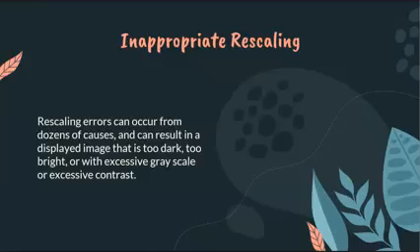Okay, but that is not the case for CR systems because as you can remember, ang pag-scan ni CR system is kinascan niya ang whole plate, so included yung mga unexposed and exposed na pixels, of which na dapat ang exposed lang na pixels ang kailangan ni computer. So if that happens, which all the time happens in CR, of course, there is decrease, no, of the brightness or increase in brightness or decrease in contrast or an increase in contrast. So there is inappropriate rescaling of the image. Okay?